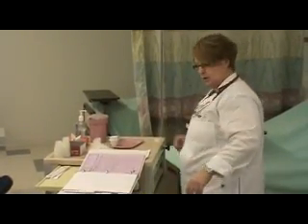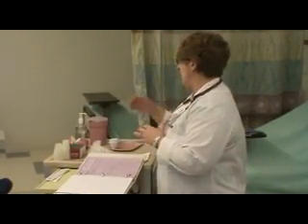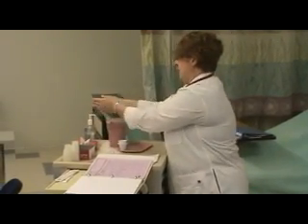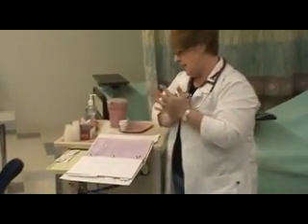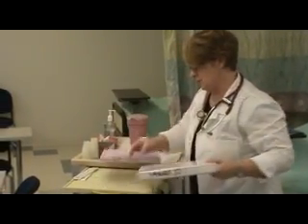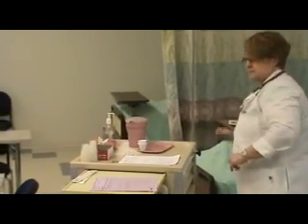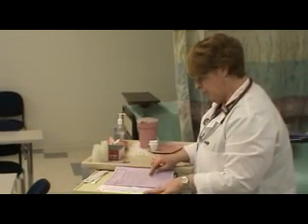Now we're working strictly with the MAR, and now that we're down to preparing the medications, after handling a chart that many people handle every day, we want to be sure that we do our hand hygiene. So we do that, and for comfort's sake here at our cart, I'm going to deal with just this one patient's sheet, and I'm going to put the binder aside. All right. So we move on.